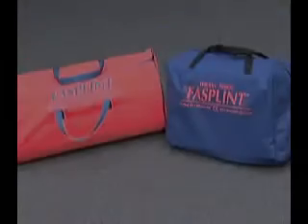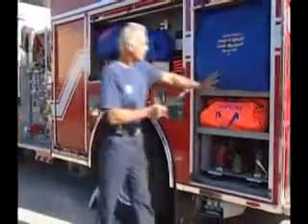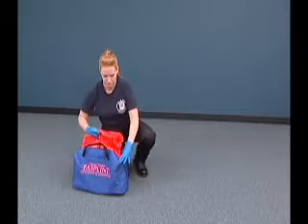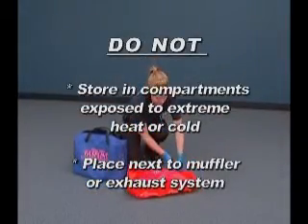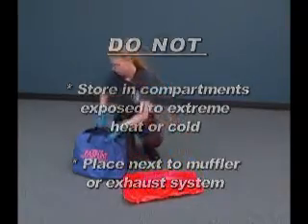The fast splint set comes in a duffel style or rectangular shaped carry case. They both easily fit in most vehicle compartments or under a squad bench. The splints and the manual pump should always be stored in their carry case to reduce the potential for getting soiled or damaged. They should not be stored in compartments exposed to extreme heat or cold and should never be placed next to a muffler or exhaust system for a vehicle.